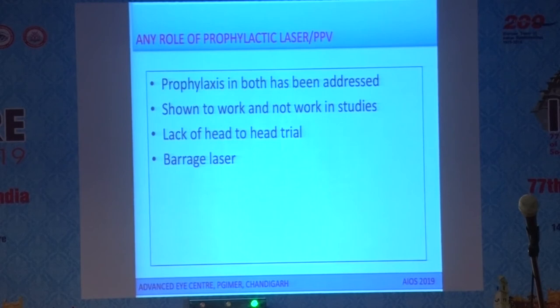Before I move on to the RD in these patients, is there any role of prophylactic laser before PPV in these patients? Of course, people have addressed prophylaxis, doing a barrage around these necrotic areas and trying to prevent RD, which they said is ultimately going to happen in these patients. But there are no head-to-head trials, and some studies show good results, some studies don't. So things are not as simple as, like, in coloboma. We really don't know whether it has a role in case of retinitis. In our hands, it has never worked. Wherever I tried doing laser, they have detached.